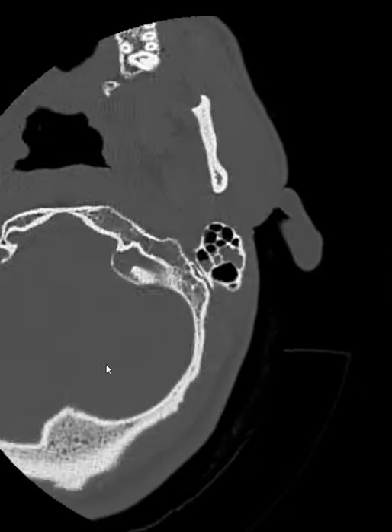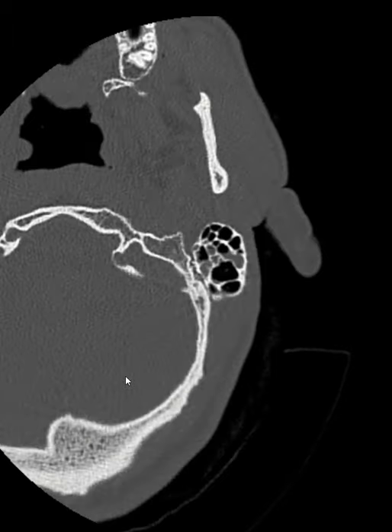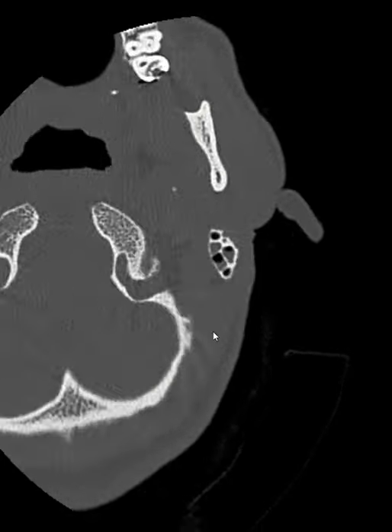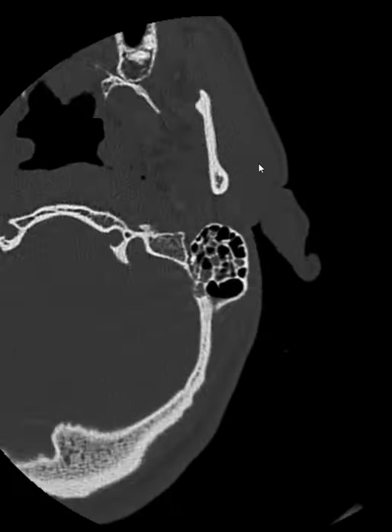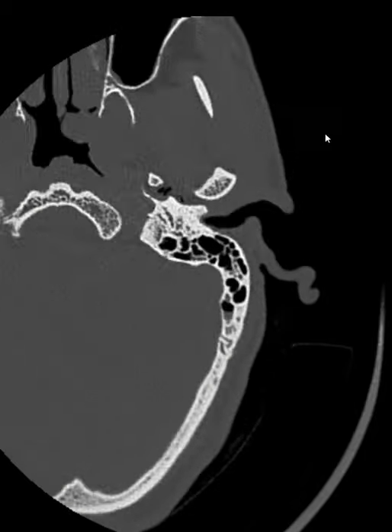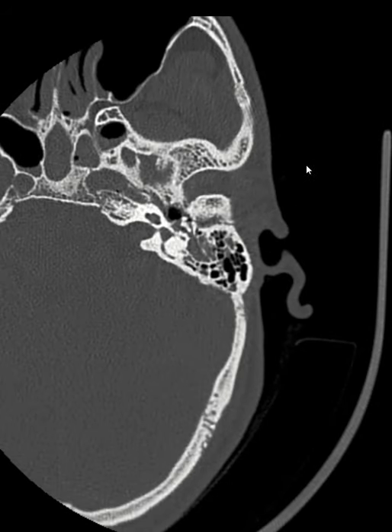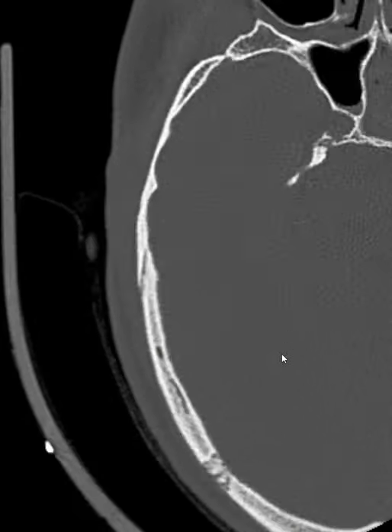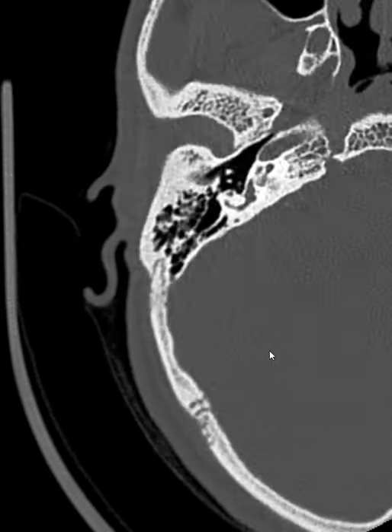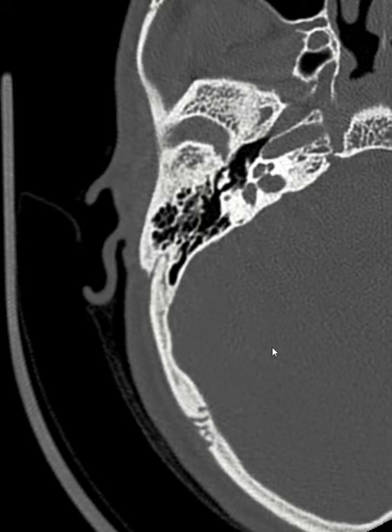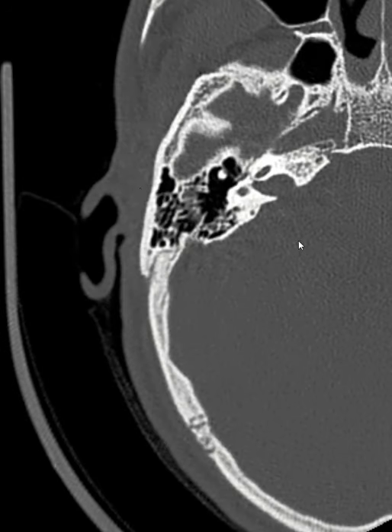The mastoid air cells are filled with blood as well. That's basically why I showed you this scan — to tell you why it is important to take an HR temporal bone. Now let us compare with the right side bone.